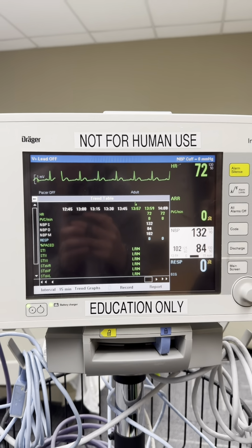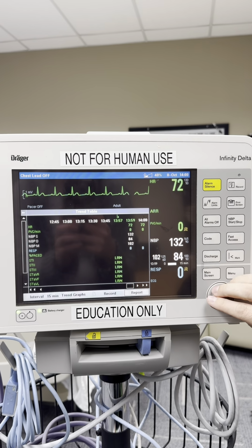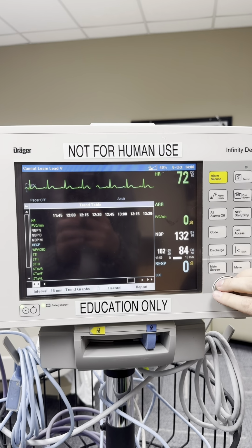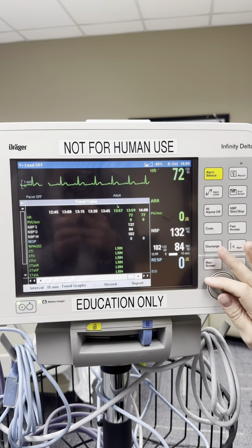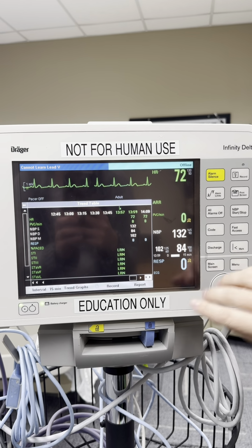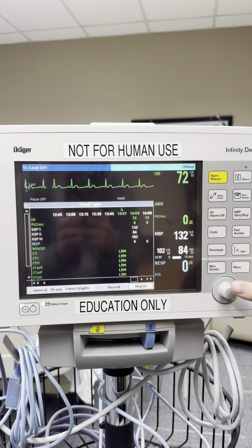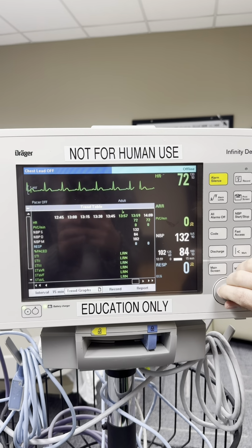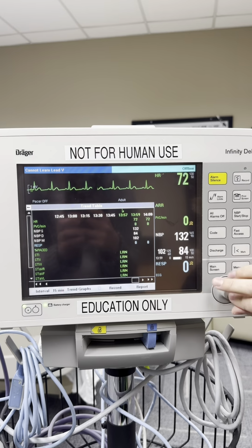If you click that, it will show your most recent vitals, and you can even scroll back to look at them. So if you are having a downtime and you need to go back, or your vitals aren't flowing over, you can go into here, and if you scroll over and highlight report, if you click that, it will print to the printer on the unit in a table format, so it's easier to copy all your vitals over into the chart.